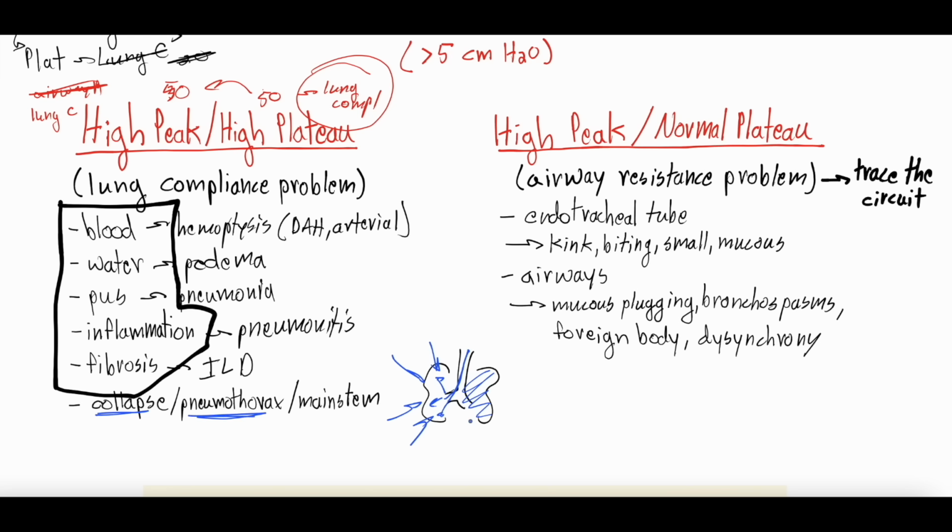Or if you have had a pneumothorax, a popped lung, let's say this lung's totally collapsed because there's a pneumothorax. Again, you're just ventilating one lung. And the amount of tidal volume is the amount of tidal volume, right? Let's say you set the tidal volume at 500. That tidal volume is supposed to go into both of the lungs, right? And if it's only going into one of the lungs, so instead of getting 250 and 250, this lung's got a pneumothorax and is collapsed down. That means now you're trying to put 500 cc's of tidal volume in that one lung, and you're going to over-distend it. You can think of it like a balloon again, right? If you're pushing 250 cc's into a balloon and then try to push 500, that pressure, that compliance that it's coming back down with is going to be more robust.